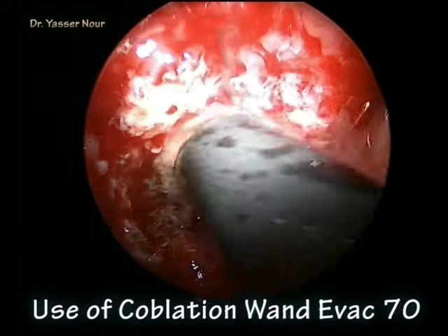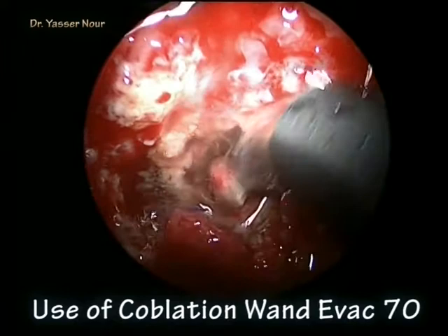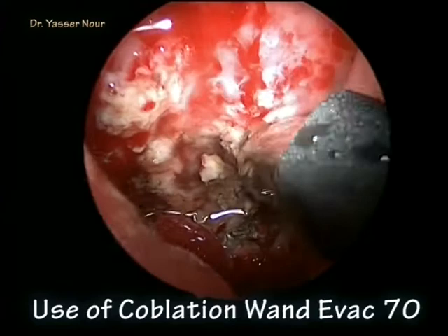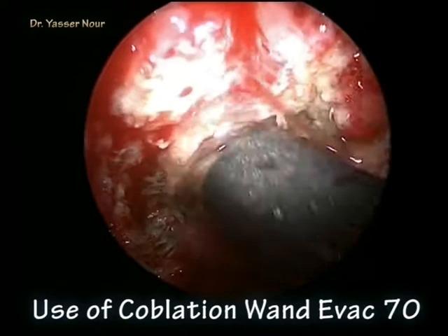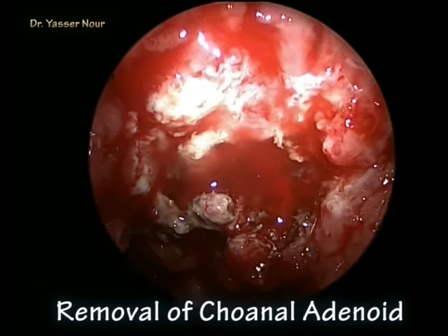You can see the Eustachian tube orifice just on the lateral side of the EVAC — this is the right Eustachian tube. The process will continue until complete removal of the adenoid. Any site of bleeding can be controlled by rapid movement of the wand, using the coagulation power as needed.